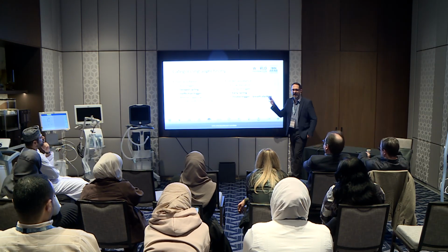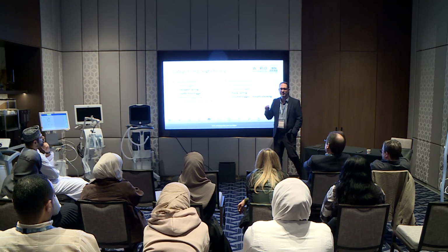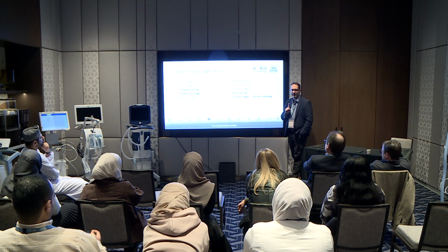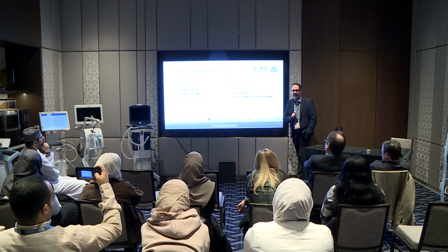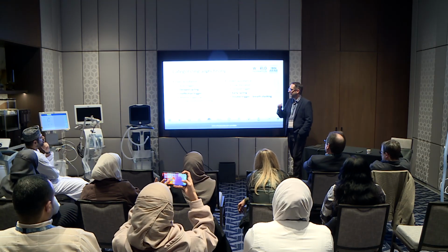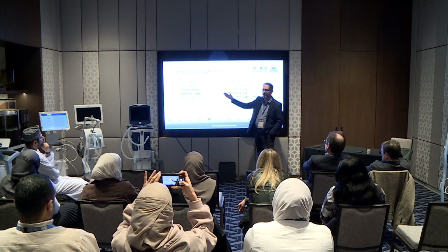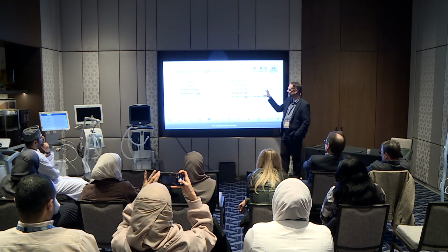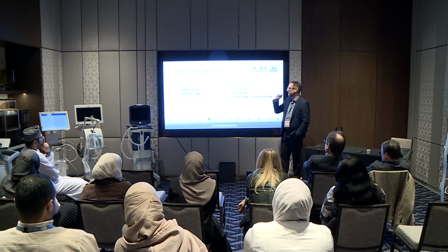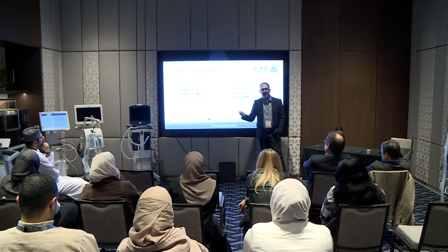Now this is how I like to classify asynchrony, okay? And every question I ask you when you have to poll, you're going to be first asked, is this over assistance or under assistance? Okay. Now how do you determine that? Well, for one thing, if you can identify the asynchrony right away, then you can classify it as over assistance or under assistance. But the reason why I like to classify it like this is because this describes the problem that's underlying, that's causing it.